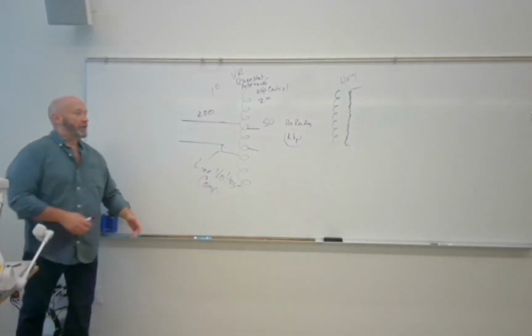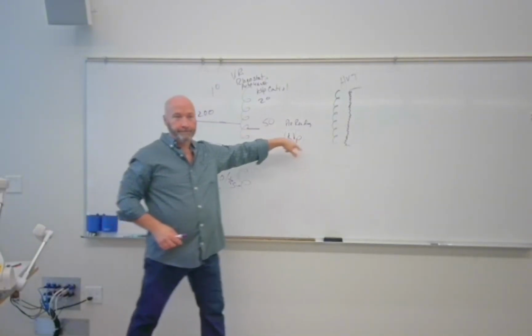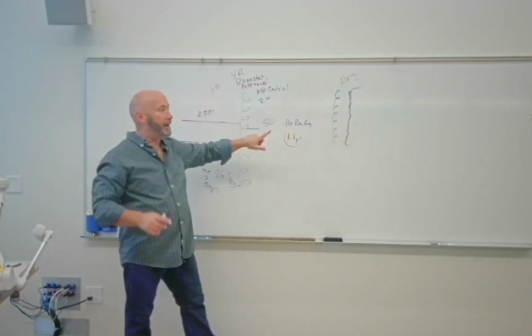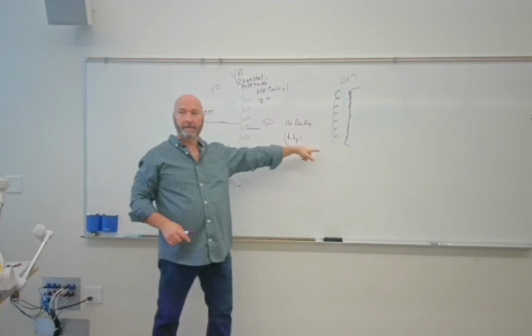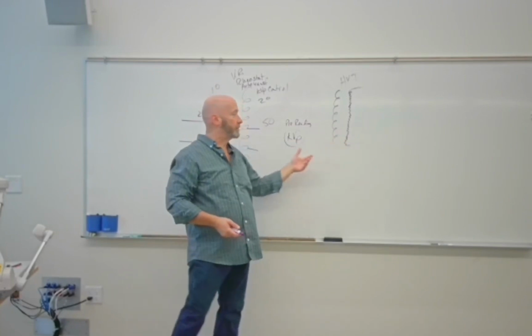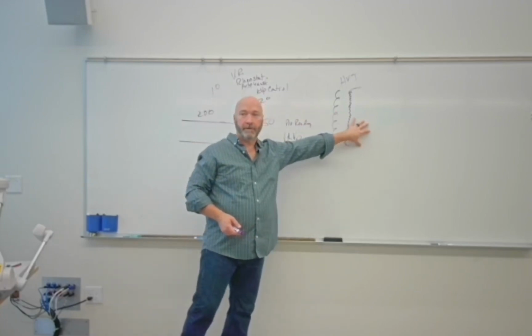All right. So it's a pre-reading kVp meter. Why is it a pre-reading kVp meter? Yeah, I don't have kVp yet. But what's a characteristic of this as opposed to this one? More turns. It's fixed. It's more turns, but it's fixed. The turns ratio is fixed. So whatever we have here, we know exactly what we're going to have over there.